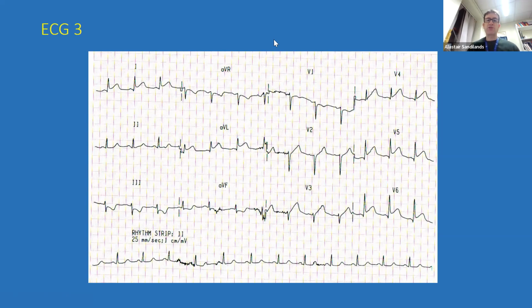How can you tell the difference between reciprocal changes and the actual change? So I think where you get reciprocal changes is where there is ST elevation. ST elevation is the trump. You can't beat ST elevation. So when you have ST elevation, that is the STEMI. The reciprocal change is on the opposite side from where the STEMI is occurring, and you will see ST depression or T wave inversion as the reciprocal change. Okay? Does that answer your question? Yeah, no worries. Good. Thank you.